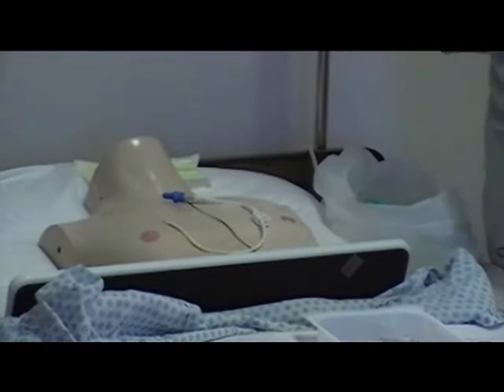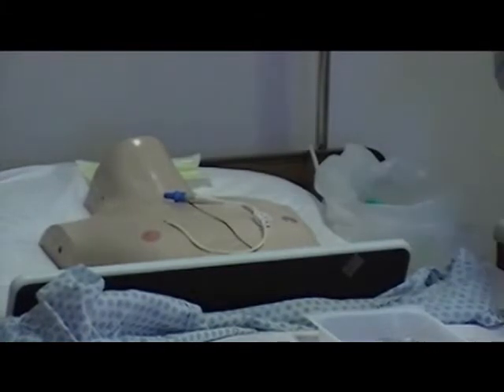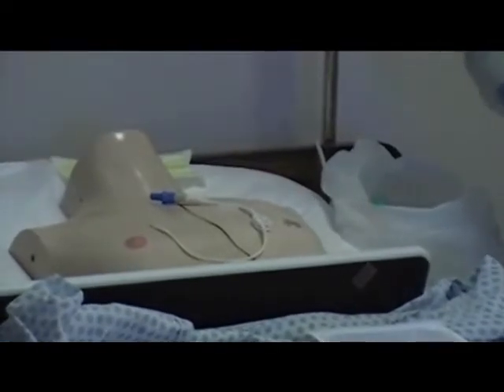So I'll remove my gloves, dispose of them. Now, I do not want to leave the bedside to get my hands clean, so that's where this comes in handy. Generally, they say about 3 to 5 milliliters of your alcohol-based solution is what's appropriate to use.